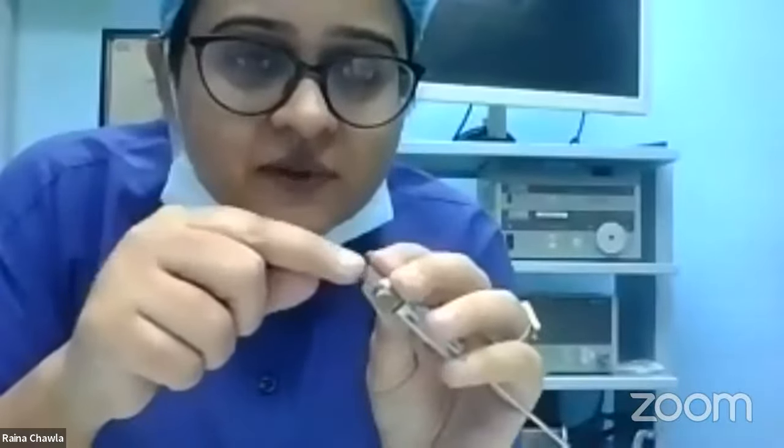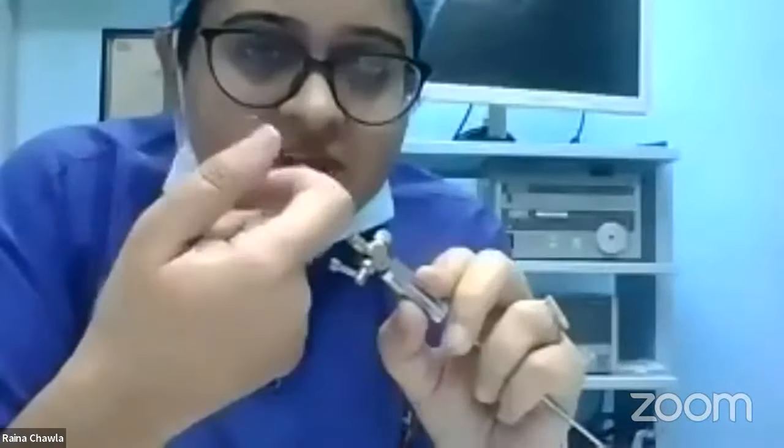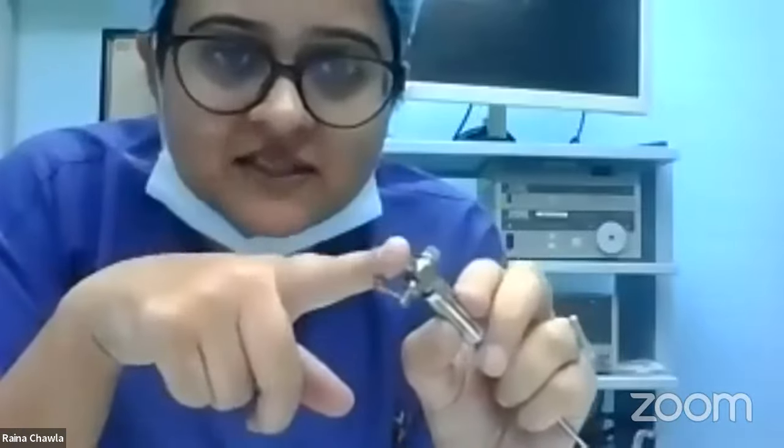So what are the other ways you know you're in the cavity? You put a drop of saline here, and it gets sucked inside because the pressure in the cavity is very low. Anything you put at the top will get sucked inside immediately. That is another sign that you're in the abdominal cavity. You can also push 5 ml of saline and then try to withdraw it. If your needle is in the cavity, you will not be able to withdraw the same saline. So these are the signs that you are in the cavity: the pressure will be negative or less than 10 millimeters, saline will get sucked in, and once you push saline and try to withdraw, you will not be able to withdraw the saline that you have put.